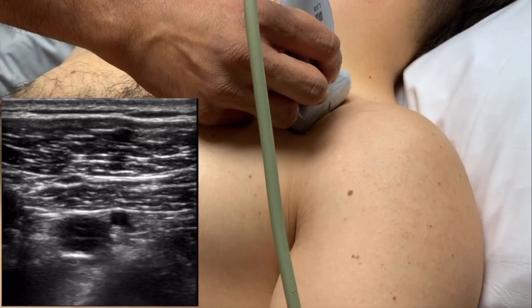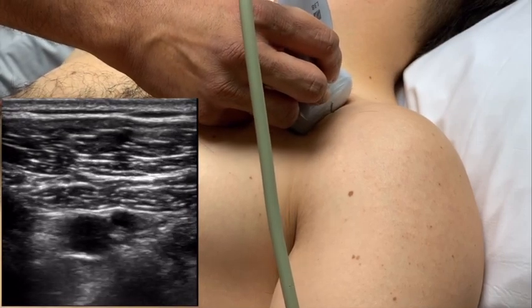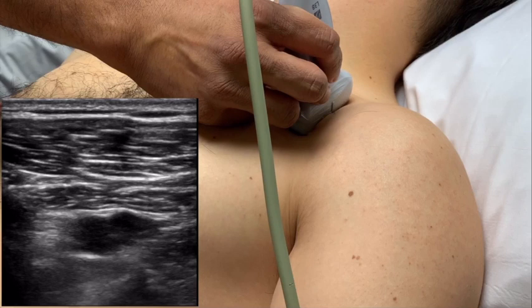PECS 1 and PECS 2. Alright, so Nick's lying supine, and I'm scanning just below the clavicle, sort of like you do an infraclavicular block, and we're going to look for the pec major and pec minor muscles. So if you look here, you can see the pec major muscle sitting on top and the pec minor muscle sitting below, and below that you get the axillary artery and vein.